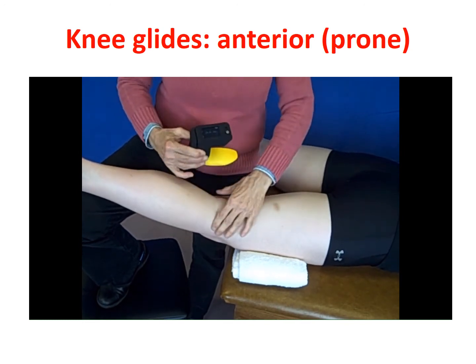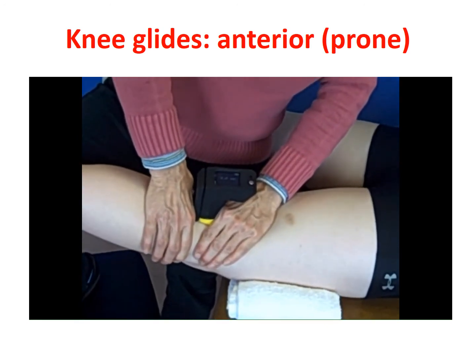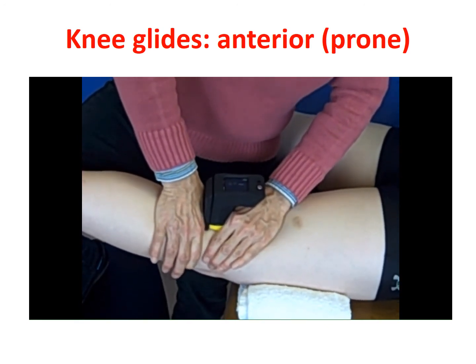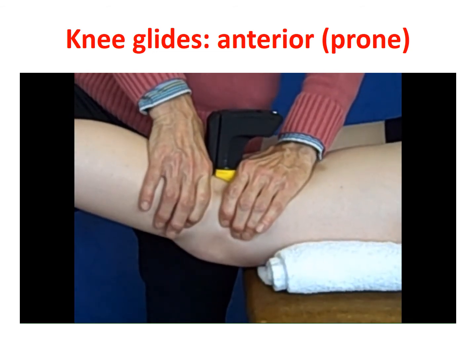So here's how you put those pieces on. And then do that anterior glide.